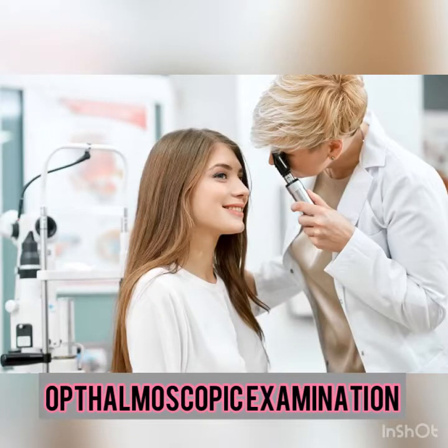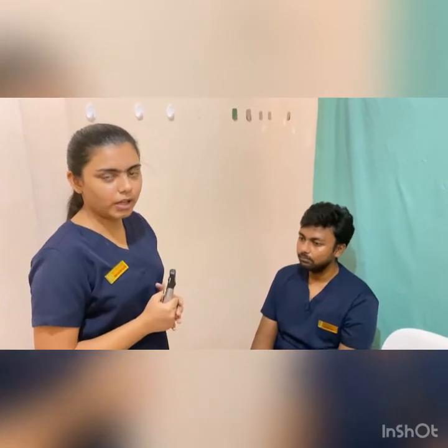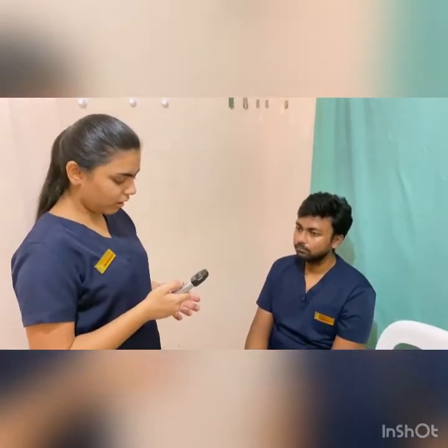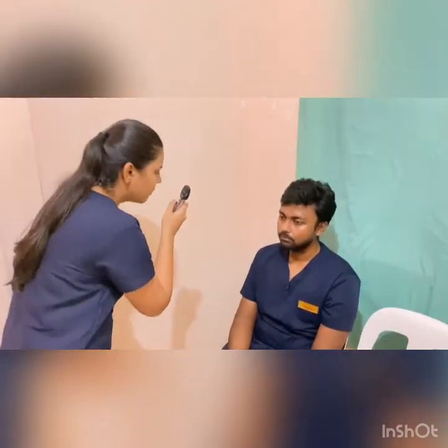Darken the room, turn the lens disc to 0 diopter, hold the ophthalmoscope in your right hand and use your right eye to examine the patient's right eye. Now we'll check for the internal structures of the eye using the ophthalmoscope. For that, first we'll see the intensity. First we'll see the eye from a distance and then we'll move slowly towards the patient's eye.